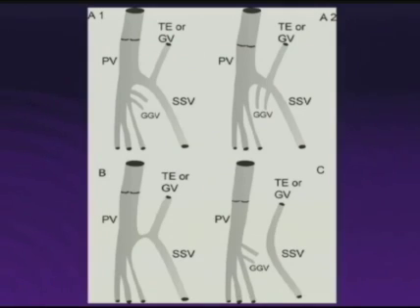When we look at the small saphenous vein, we want to recognize that this is the vein that runs through the calf and typically terminates in the popliteal vein, but there are lots of normal variants that are present, including, as we can see here in the upper right, a thigh extension vein, which extends up and often leads to the vein of Giacomini with an intact saphenopopliteal junction, or down here, a thigh extension vein with an absent saphenopopliteal junction, or variants of that as seen here on the bottom left of just a small saphenopopliteal junction.